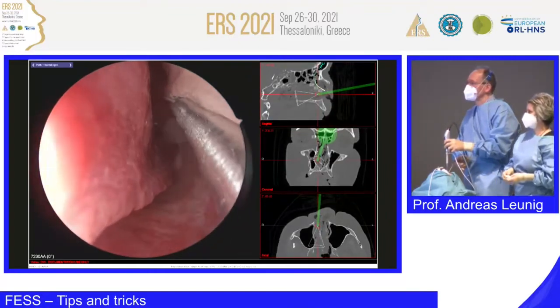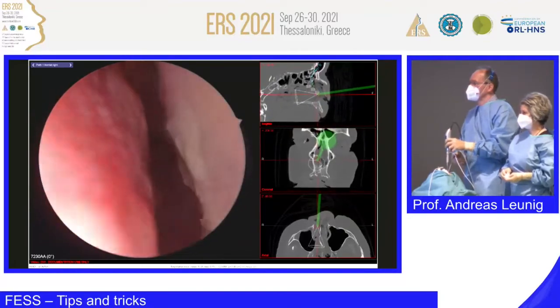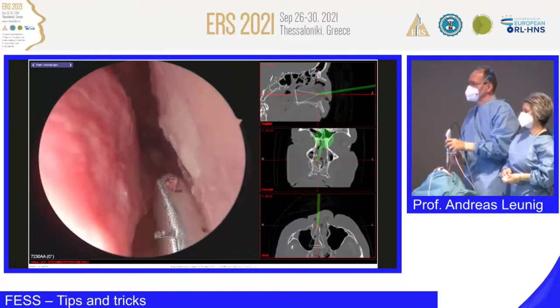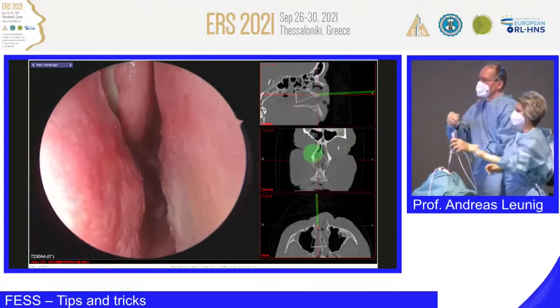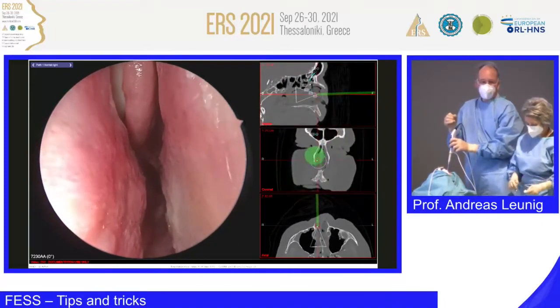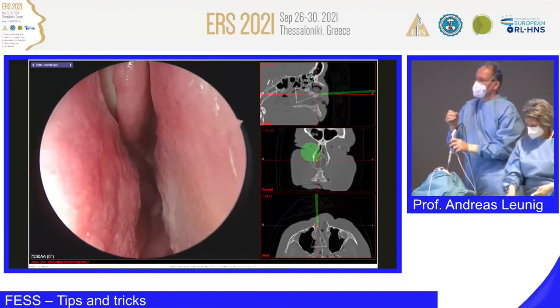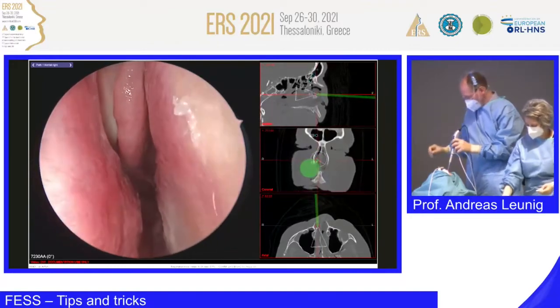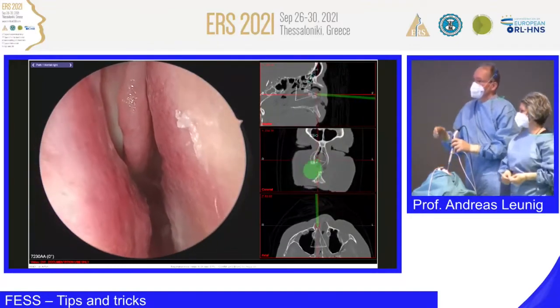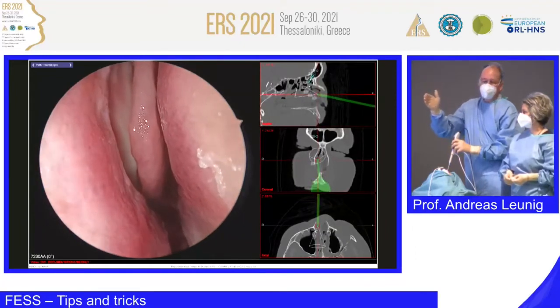Andreas, can I ask, yes? How do you prepare the nose preoperatively? Ah, that's good. That's perfect. Thanks for the question. Usually we use cotton swabs, which are soaked, but they should not drip, 1 to 5,000 with adrenaline. And we wanted to show you, but we don't have it here. And we place it in the middle meatus around the middle turbinate.